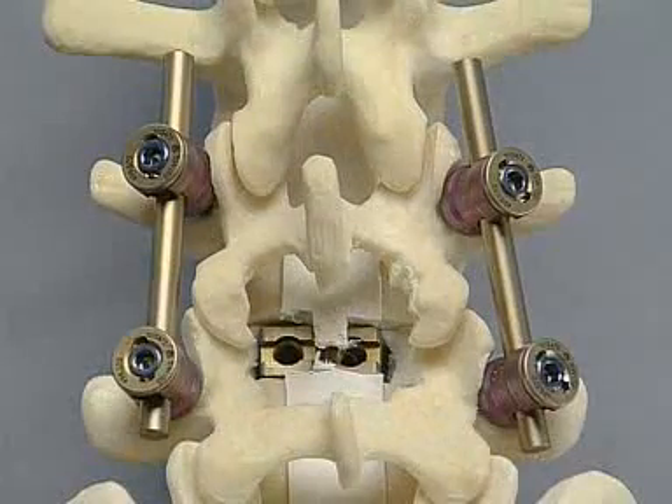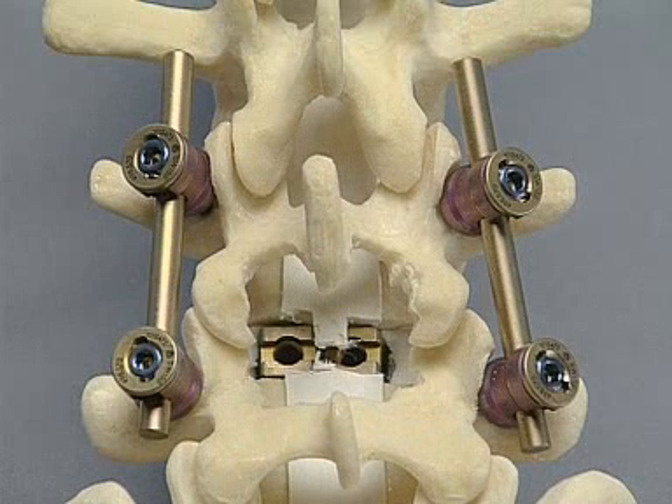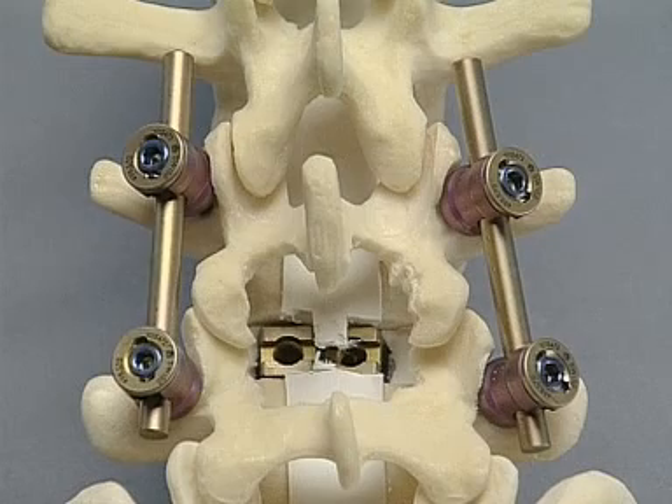In this exercise, an L4-L5 interbody fusion will be undertaken with Contact Fusion Cages. As with other cages, Contact Fusion Cages are not stand-alone implants, so they require additional posterior instrumentation. That can be either translaminar screws across the facet joints or, alternatively, a pedicle screw system. In this exercise, the Cliquex system will be used.